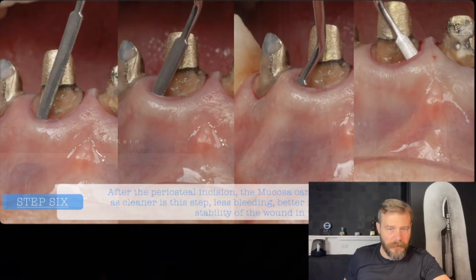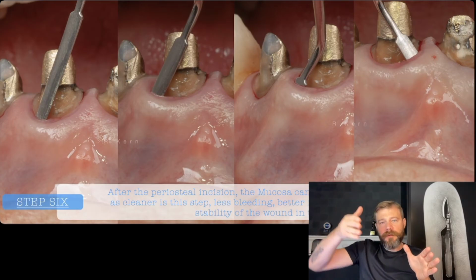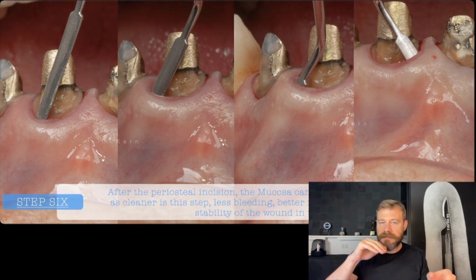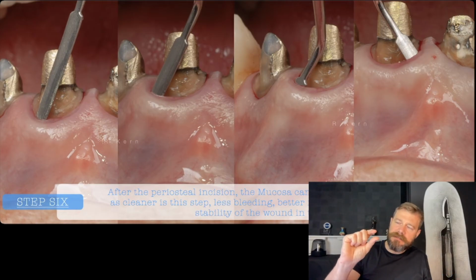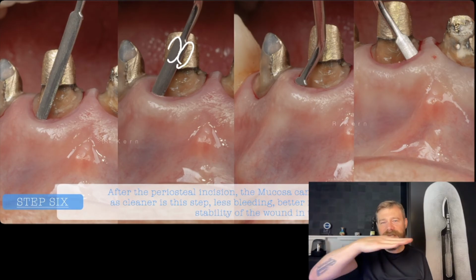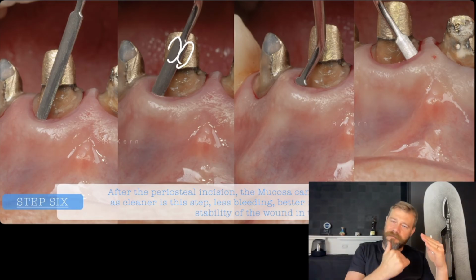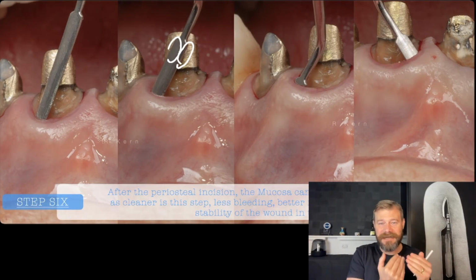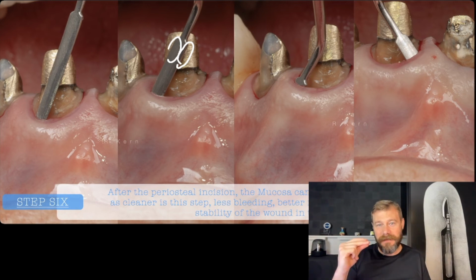What else? Okay, this instrument also was developed to follow the previous work when you have used the microblade to detach the mucosa from the muscles. This instrument has a cutting edge, okay? Two-thirds of the instrument is sharp, but it is not sharp here. So you can go with this instrument inside the area and really check if the mucosa is completely detached from the muscles below. So it's a little bit sharp. If you still have some fibers attached to the tissue, you can detach them very fast.